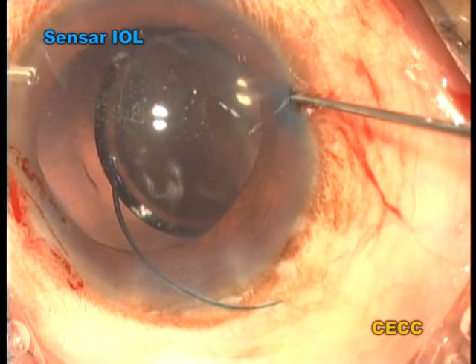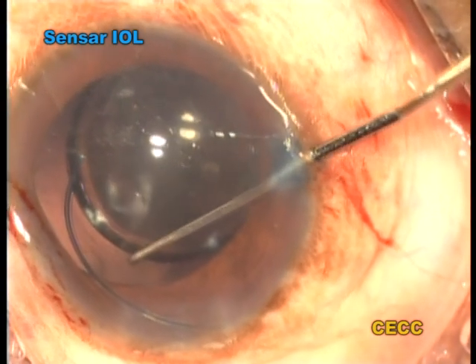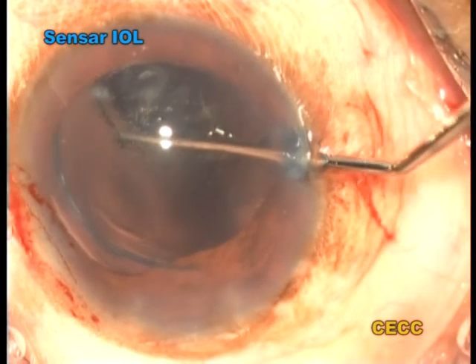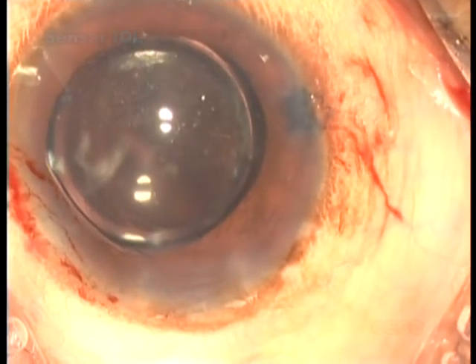This is the final case in this series, where a sensor IOL is implanted using the emerald series with 2% methylcellulose. Everything apparently went off well until the final stage. The white deposits visible on the IOL surface are usually not a cause for concern, since they disappear by the time the patient is seen on the next day.